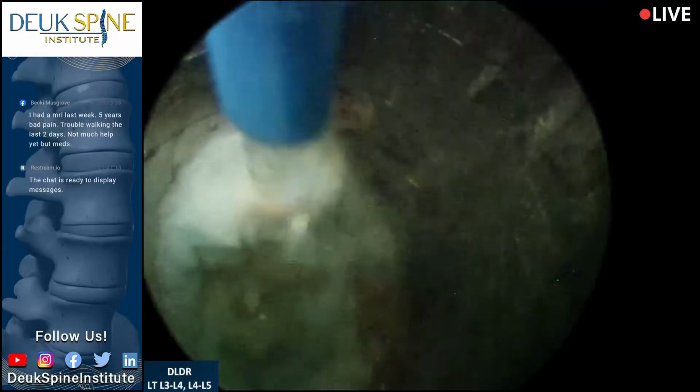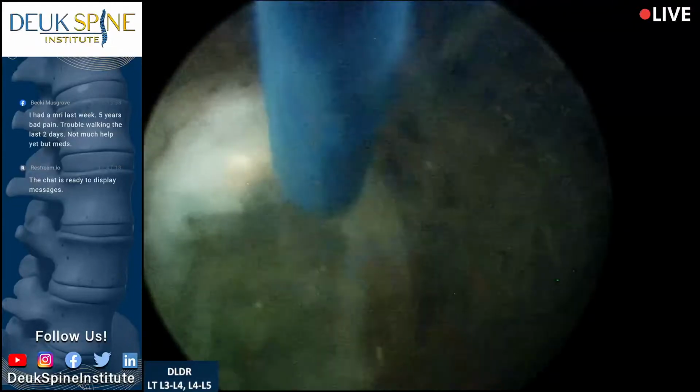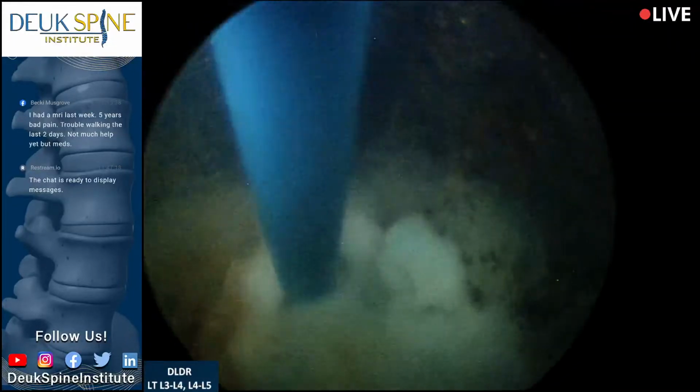Let's go ahead and show our audience exactly what the Deuk laser disc repair procedure is. We have an animation that will help you understand it.